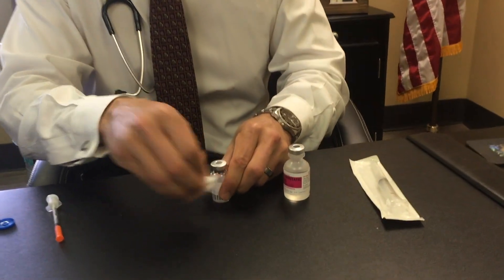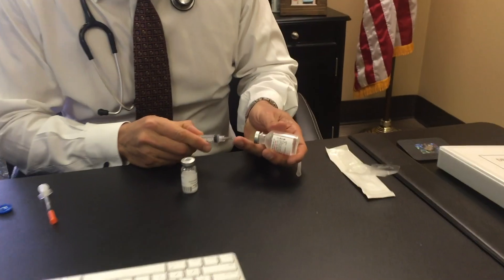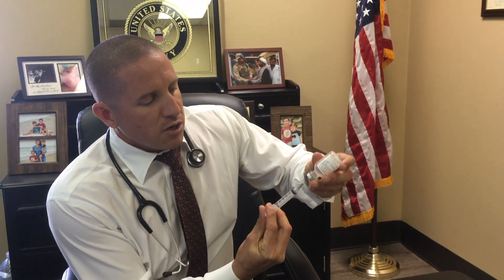Get a bunch of alcohol pads — you always want to alcohol off the top of the vial. Then get a 3ml syringe with a big needle. That's not the needle you inject with; you're going to stick that directly in the center of the bacteriostatic water.